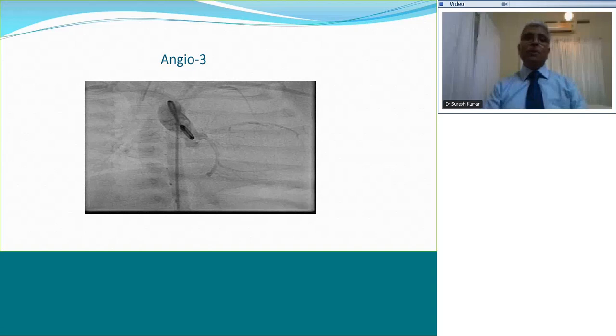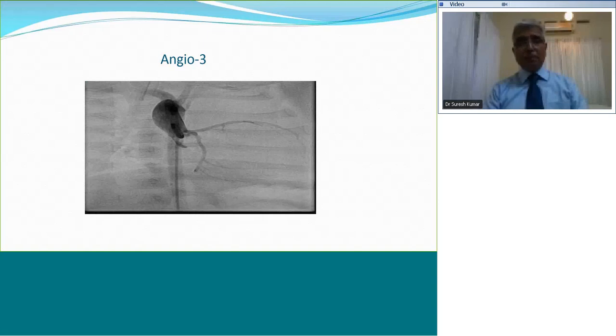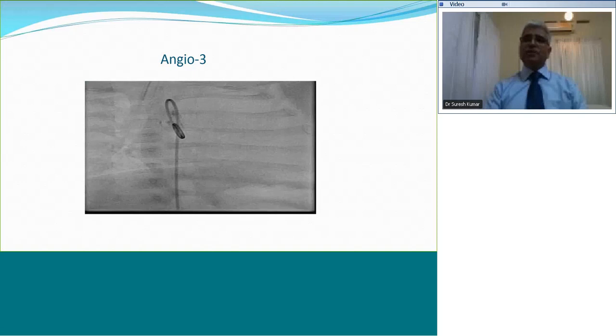It is balloon aortic valvulotomy. Yes. Once again, when you are describing the angiogram, remember it's an aortic root angiogram which shows a doming aortic valve, and the next image shows the balloon across it. And the other question was, yes, retrograde aortic root angio. Try to say it completely.